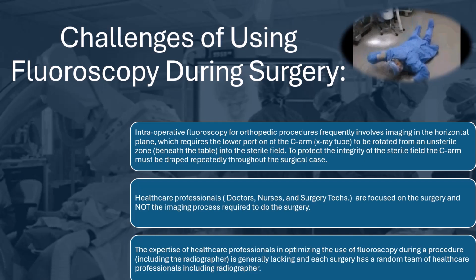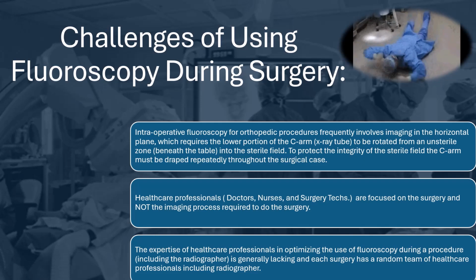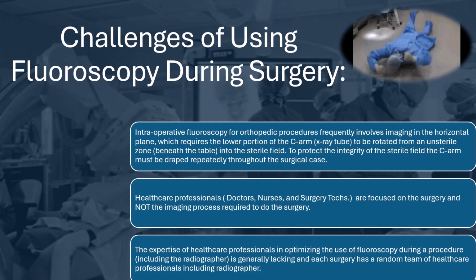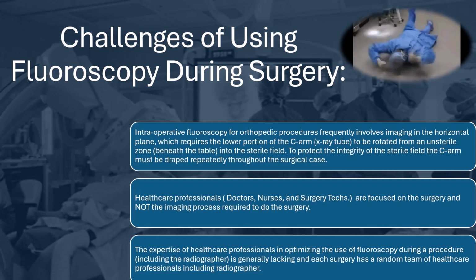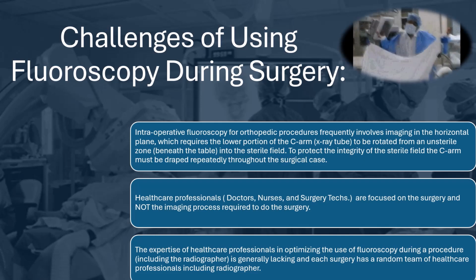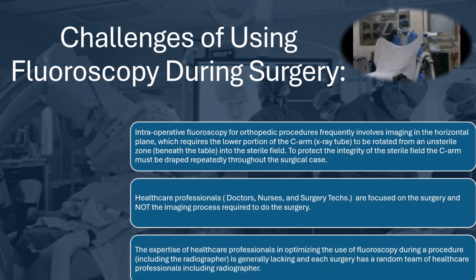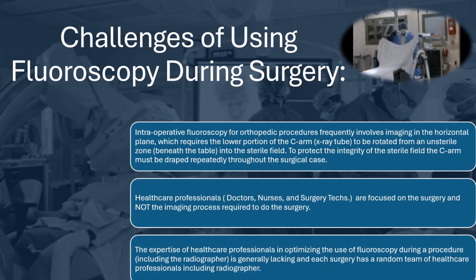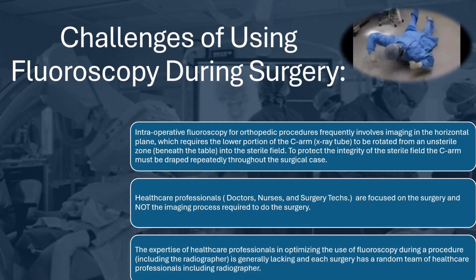In addition, when using the C-arm in surgery, we find that we have single plane imaging. Fluoroscopy can only obtain images in one plane at a time, which can limit the surgeon's view during complex procedures. Next, we talk about the image quality. While fluoroscopy provides real-time imaging, the quality of images may not be as high as other imaging modalities. And lastly, sometimes we have to use contrast media to be able to use fluoroscopy in surgery, and we can have a reaction to it.